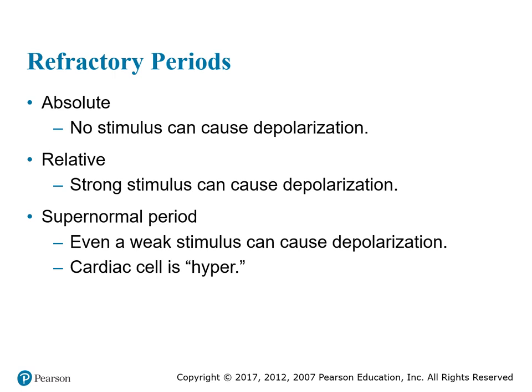When it's in its relative phase, a strong stimulus can cause a depolarization, but usually this doesn't happen until after you have formed your first QRS. Then you might see another R wave, not necessarily a whole QRS, but another R. Then your supernormal period is when even a weak stimulus can cause depolarization.